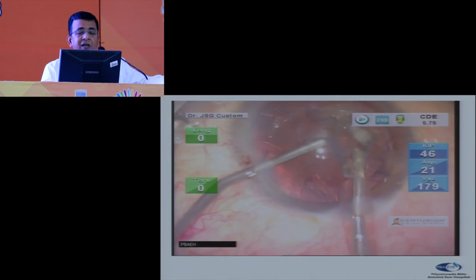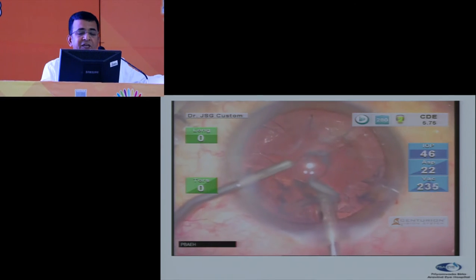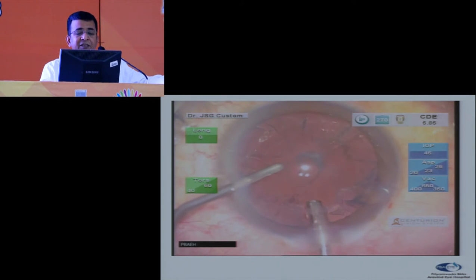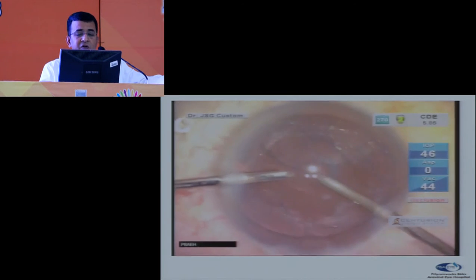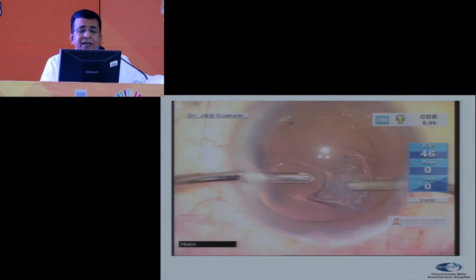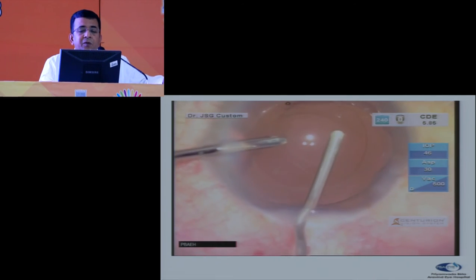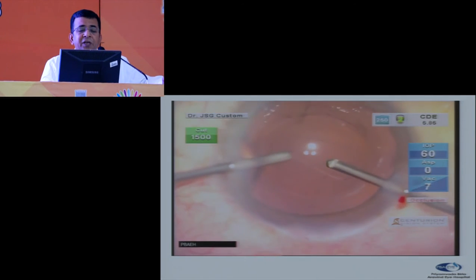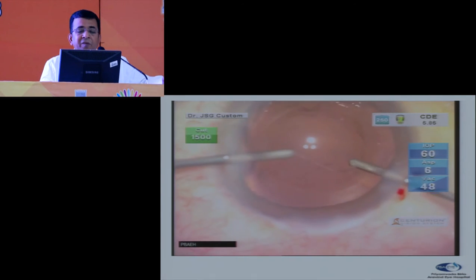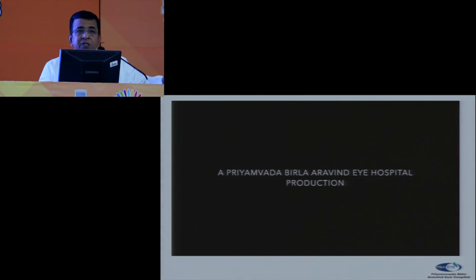And then with the help of additional instillation of visco, I can aspirate the remaining pieces as I thought that my visco content in the chamber was going down, so I needed to replenish it. So I have a rent, I have a central dehiscence, it is still under control at this point of time. And then we can go in for the bimanual cortical aspiration. And we see that we have a spindle-shaped rent within the central part. My equator is more or less clear. I can put in more visco, I can carry out some anterior vitrectomy, and ultimately, once the thing is completed, I can put a lens inside the bag. So this sort of setting helps us to reduce the size of the rent, prevent a nucleus drop, prevent a drop of the cortical matter by controlling the procedure intraoperatively.